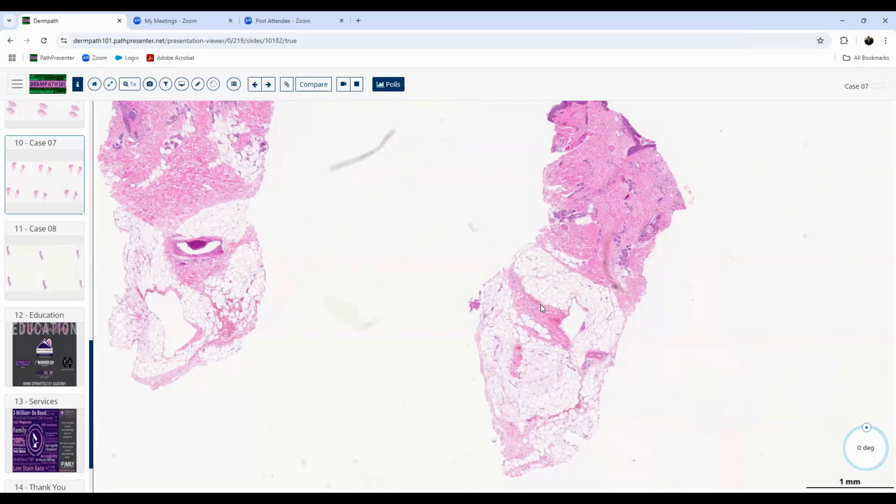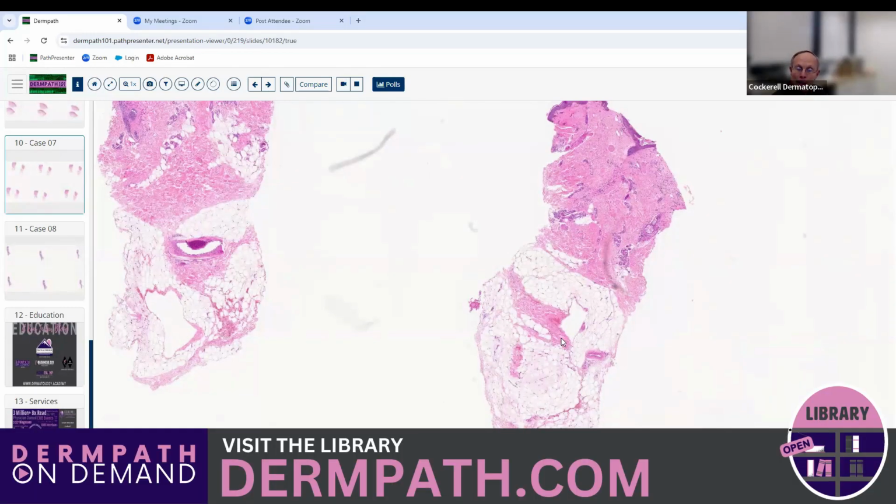fat. Well, this is a good biopsy. I mean, the person's got quite a bit of nice fat here. I don't know that they're obese or anything. They got fat in the specimen, which means it's a good biopsy. But if you look at somebody's fat here, is this normal?